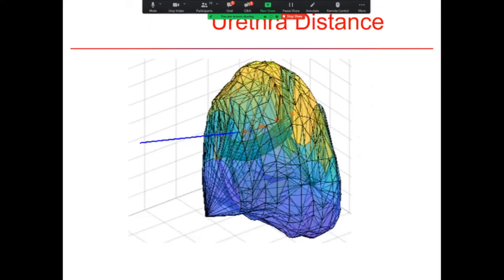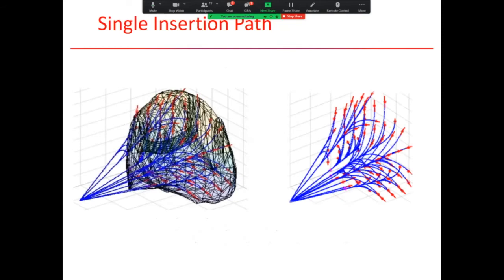The needle, obviously, is bent and tries to reach the same amount of trajectories as with the straight needle. It generates different scenarios of paths, and we try to choose the ones which minimize the number of insertions. One of the most important assumptions to be noted here is that the algorithm receives a seed plan previously prepared, and the location of each seed must agree with the seed location in the original plan.